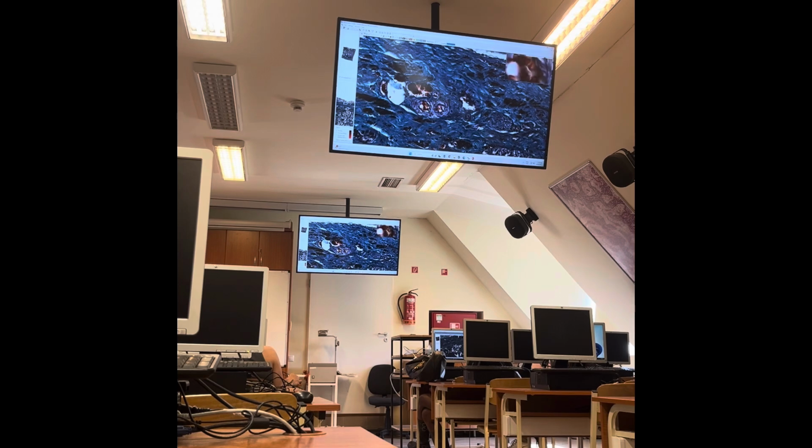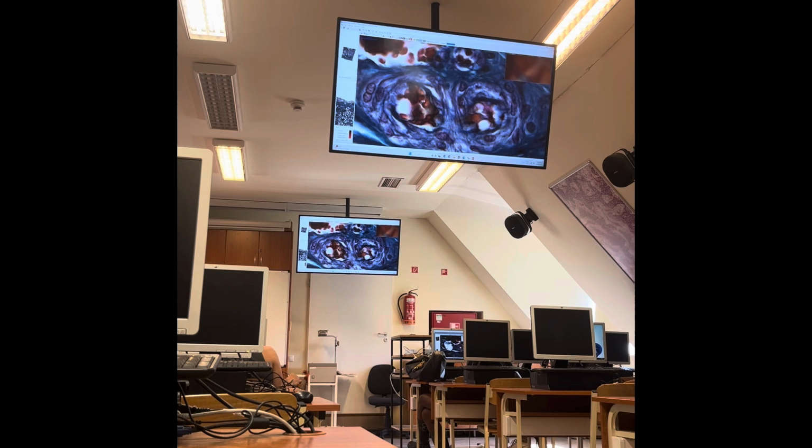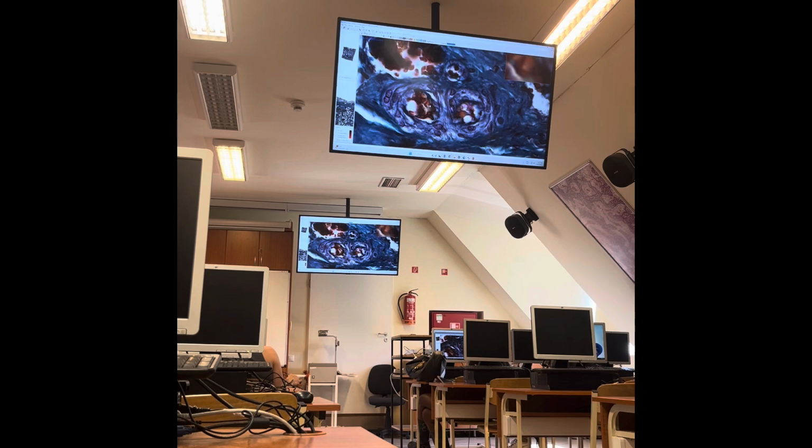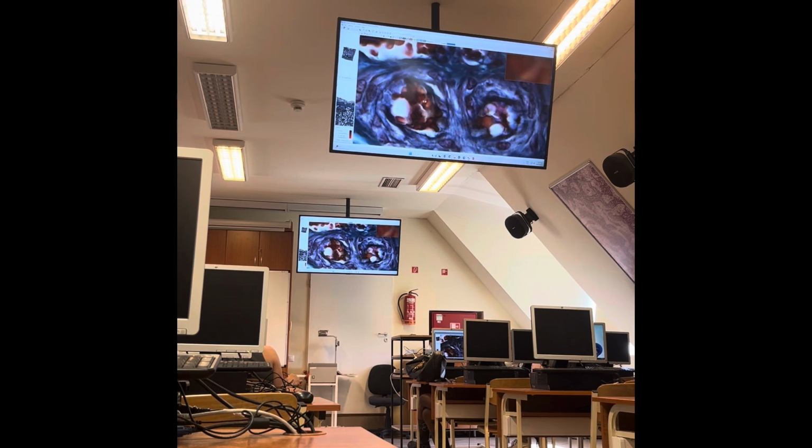Then in the lumen of the blood vessels, we can see red blood cells, and now we can see this orange color. So orange is for the cytoplasm in general, red blood cells here, and then for most of the cells, the cytoplasmic staining is reddish orangey, sometimes purple.